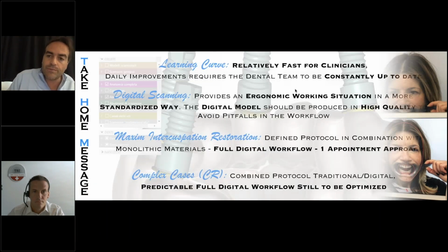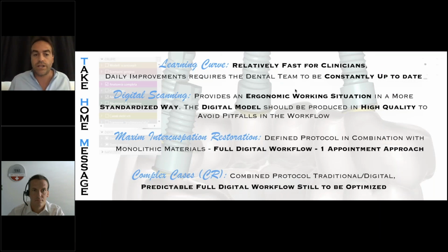We need a learning curve, but now it is relatively fast for the clinician. Digital scanning, as I said, provides an ergonomic working situation which is standardizing the way. We need a digital model, but we need to produce the digital model properly. Maximum intercuspation restoration, so single cases, simple cases, full digital workflow, one or two appointment workflow, it's here to stay. It's already reality. Complex cases, we still need to optimize a predictable full digital workflow, but we are almost there.